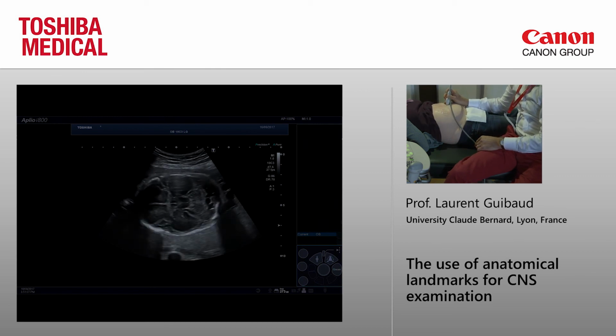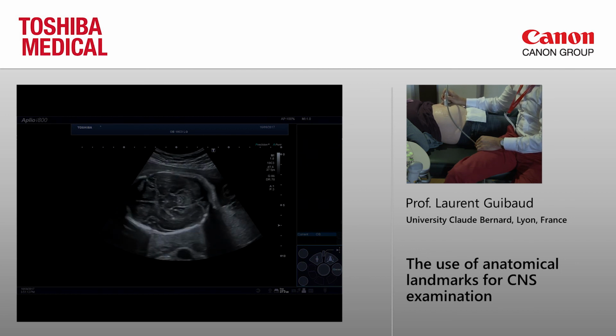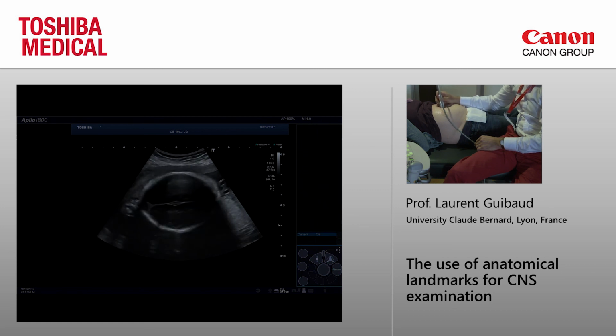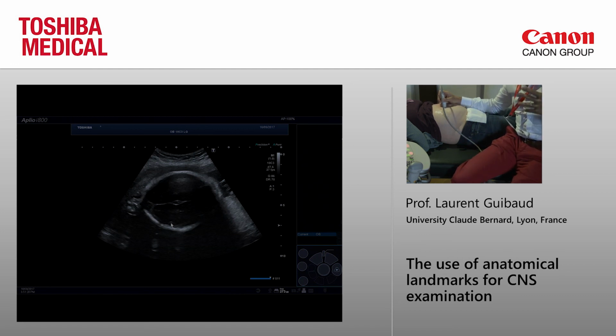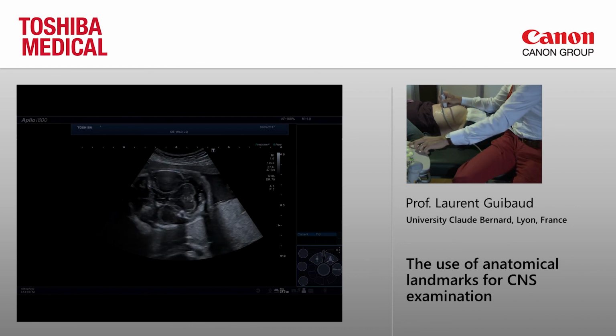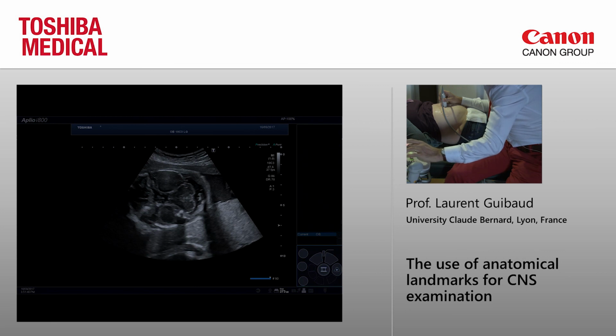So any question? Here, if we go up, you see there is this small depression, which is here, around 26 weeks, which is the central sulcus. So if you look at the brain, you are sure of the maturation. If you look now at the TCD, 26, it should be 29, and we'll measure it.